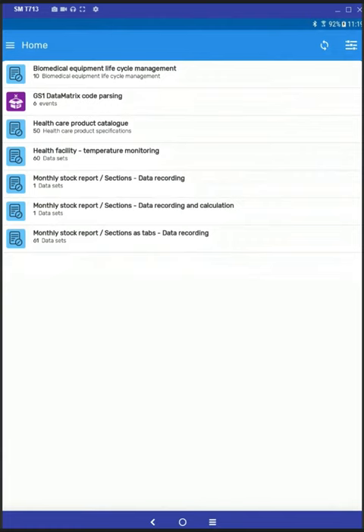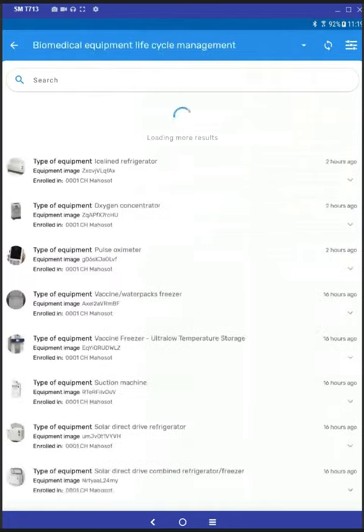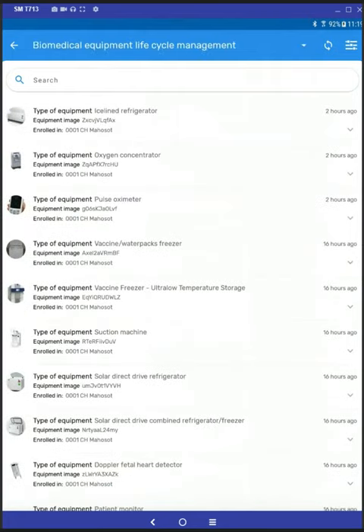Okay, so I'm going to briefly demonstrate our Biomedical Equipment Lifecycle Management Tracker Program. You will open it from the home screen by tapping on the item, and that will open a list of the equipment.